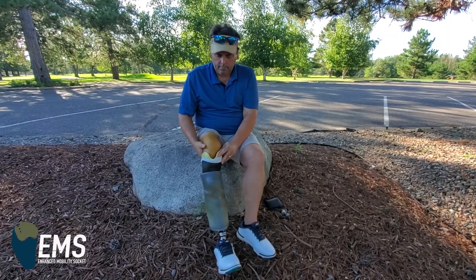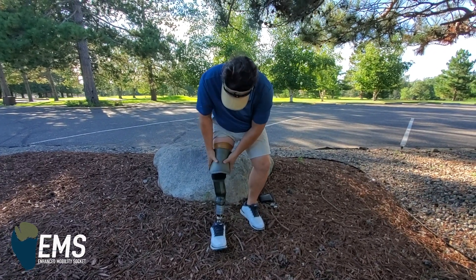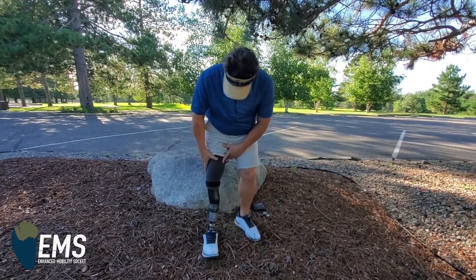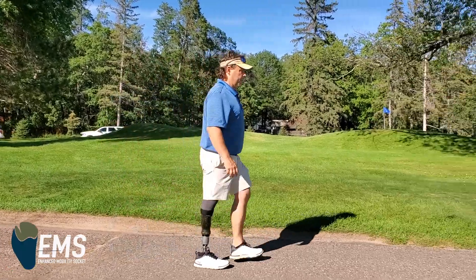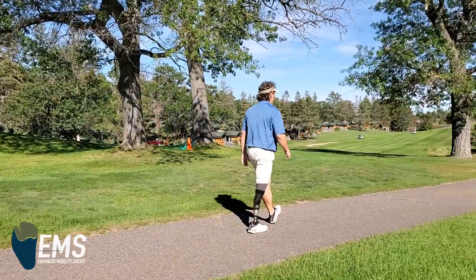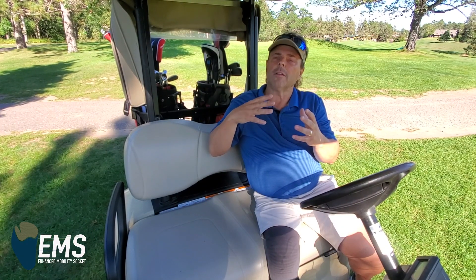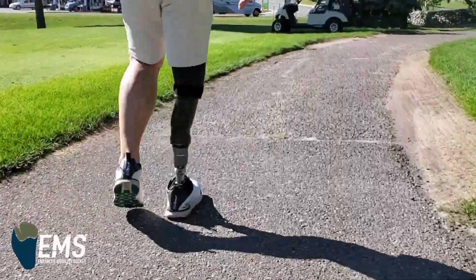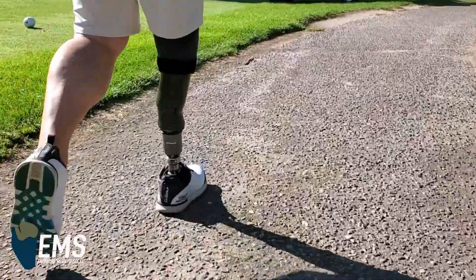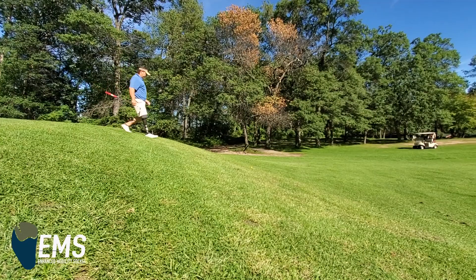With EMS, I'm connected — and I keep using that term connected — but it really is all about how I interface, how my residual stump interfaces with the socket. So when I'm walking, I can actually make muscles fire because I know where I am in my gait in that process of stepping through. Even though I don't have toes and I don't have an ankle, I can still mentally fire those things at the right times as I go through my gait, and I can feel where I am in that EMS socket and how it's reacting to the ground, at what point to make those things fire.